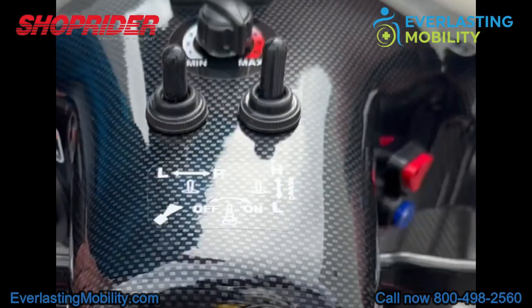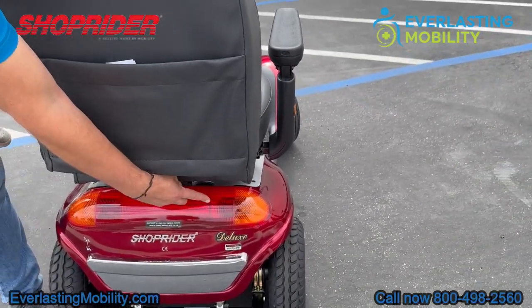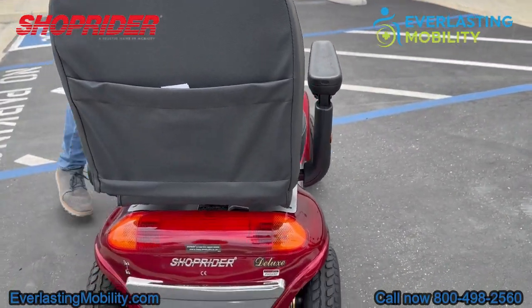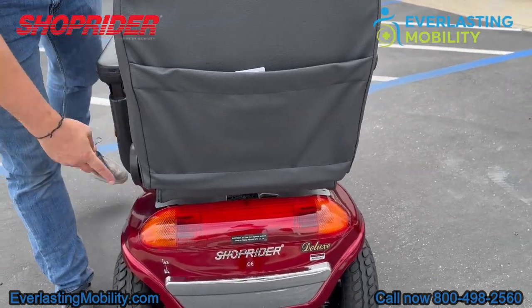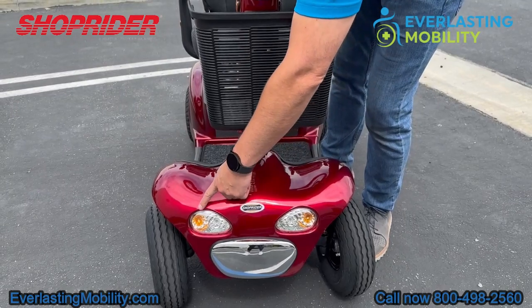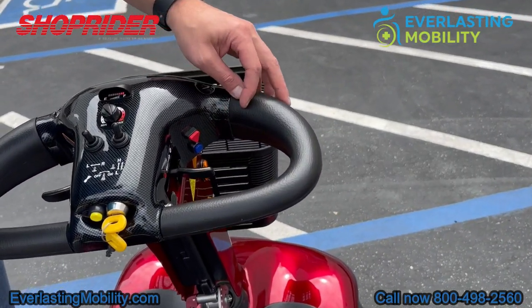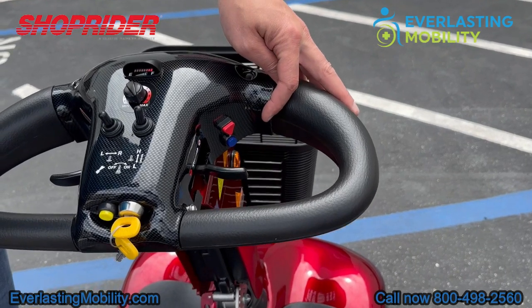This switch on the left of the high and low speed control switch controls your left and right blinkers. Here's what the right rear blinker and left rear blinker look like — they're a little hard to see in the daytime. The two front headlights each also have a blinker. Right above the lighting package, this triangle is your hazard lights.